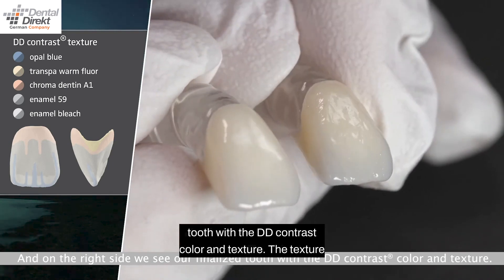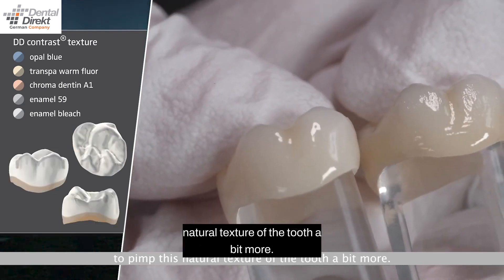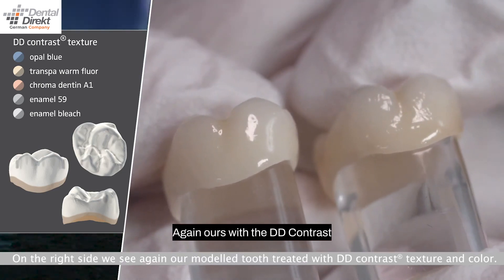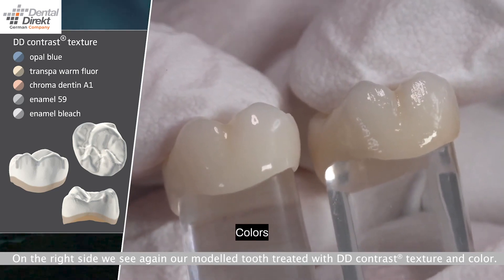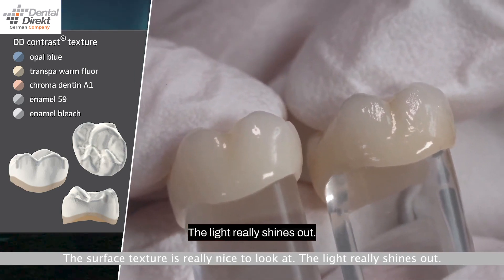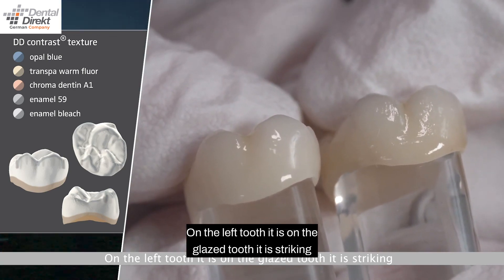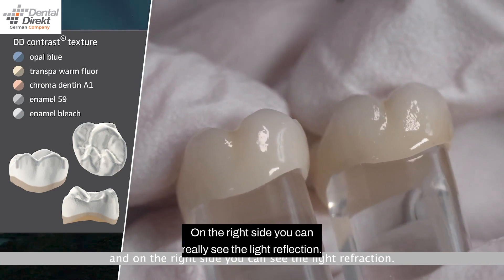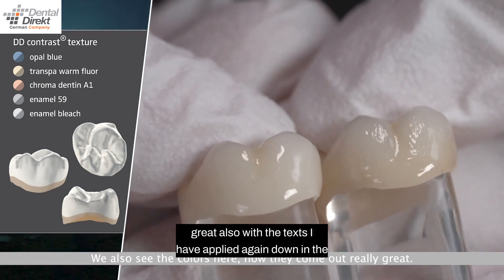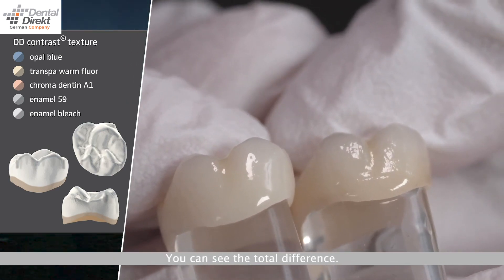The texture suggests a little bit more naturalness to pimp the natural texture of the tooth. The right side again shows ours with the DD Contrast texture and colors on the machined model tooth. You can see the surface texture really nicely — the light really shines out. On the left glazed tooth it is striking, but on the right side you can really see the light reflection and the nice colors come out great. You can see the total difference.